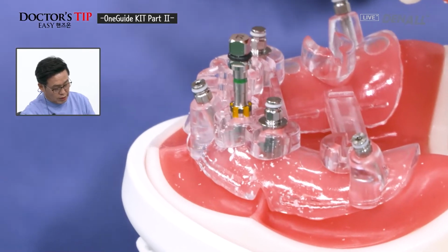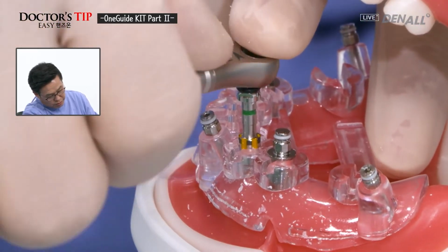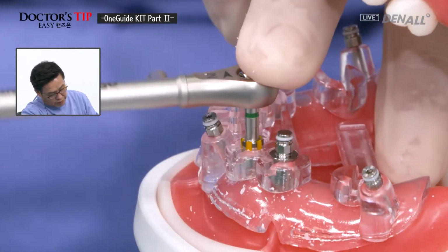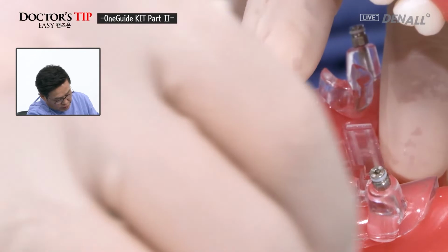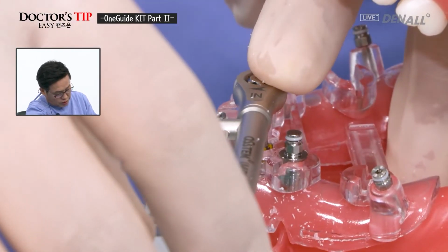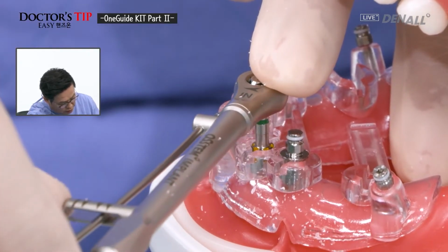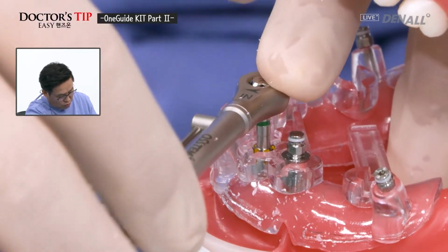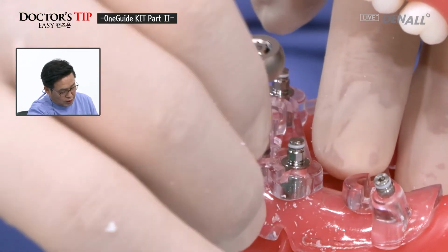Connect fixture driver and use hand wrench. Check the final position. The yellow needs to be accurately aligned. There is a guide hole front and back, so 30 Newton centimeter you can see here. Position it accurately and connect it.